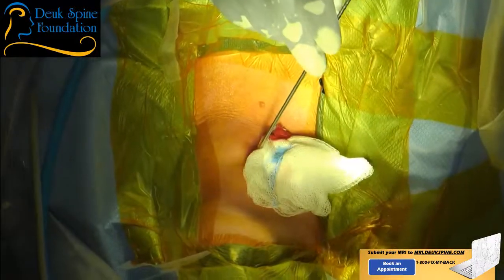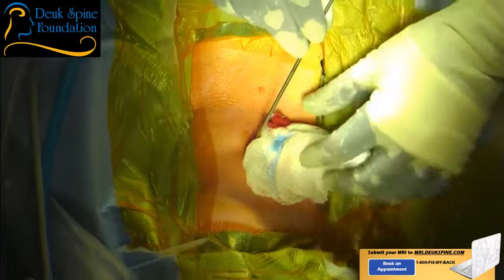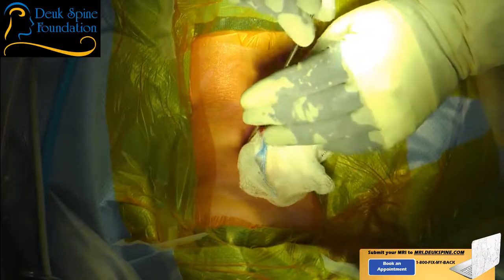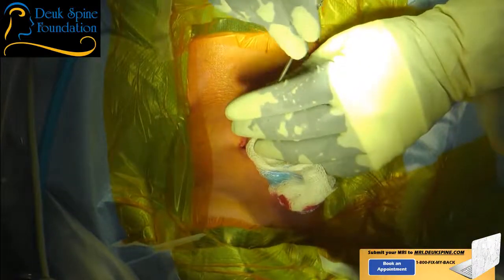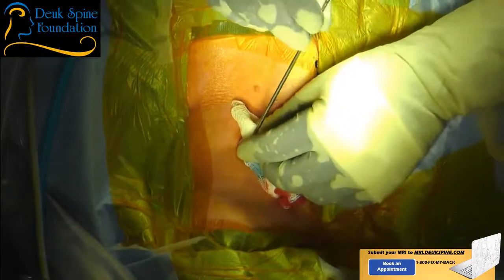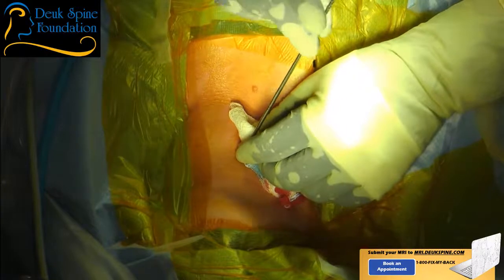Shot. Want to make sure that we don't advance the guide wire down. What's that? Oh, you just pulled their arms. Not too hard. Shot. That's pretty good right there. So I'm advancing the dilator through the tissues, and we're making our way. You can relax a little bit, just a little bit. Do a half pull.